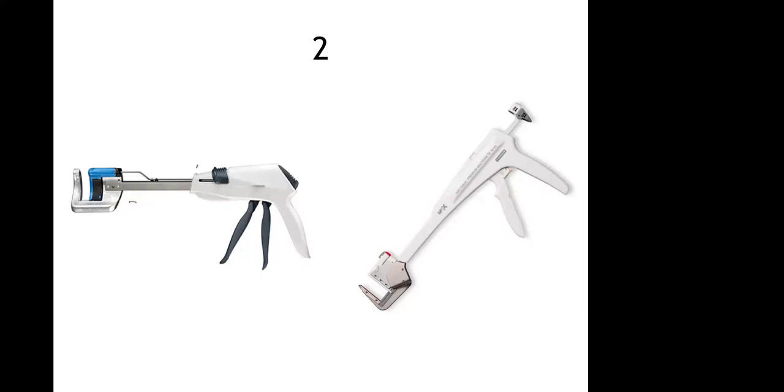When you are doing a lung resection, in esophagus also you can use it, but specifically for lungs, a lobectomy or even a segmentectomy. So, what is the prerequisite for applying this stapler when you are doing a lung resection?